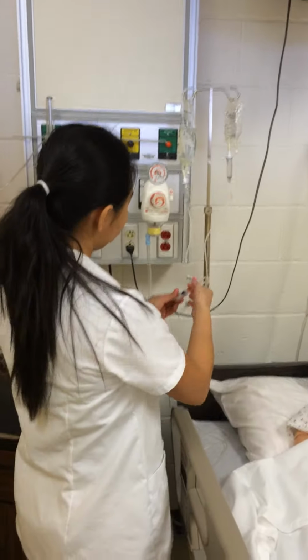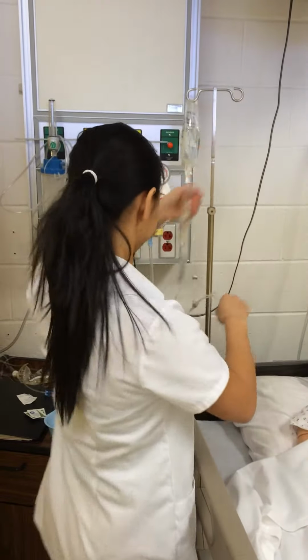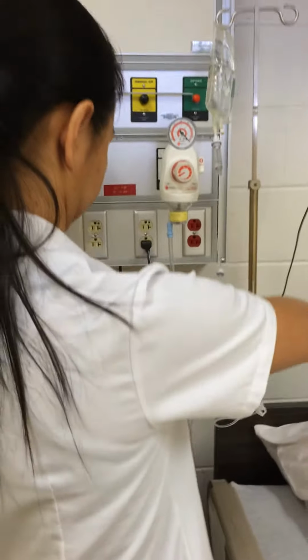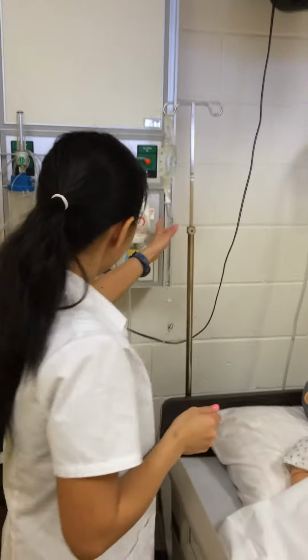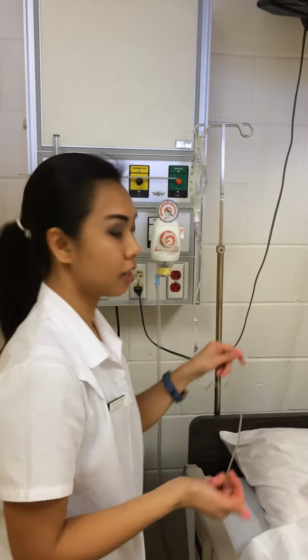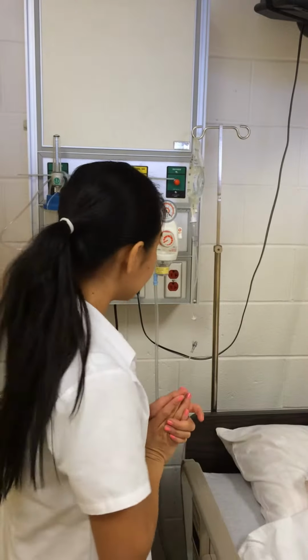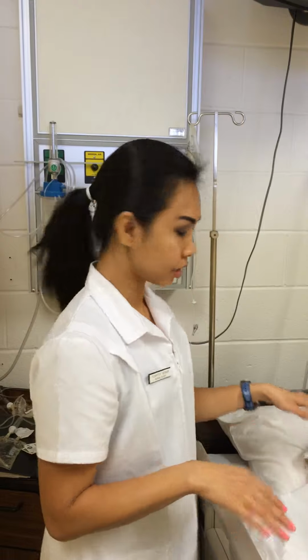So I stop the medication and remove it. And I will recalibrate the drip factor for the primary IV. Go back to 60 drops per 1 minute as at the beginning. So since the patient needs to be changed, I'm going to change the gown for the patient.